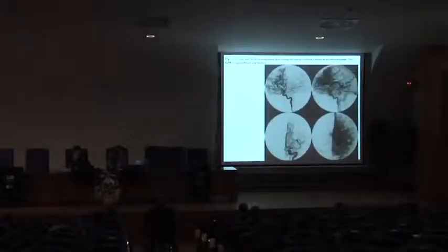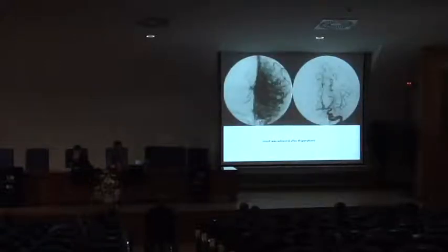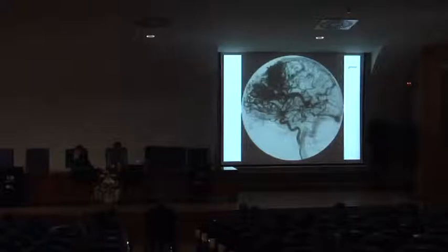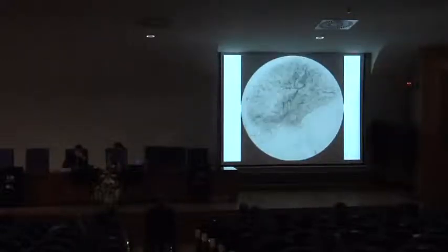And as the patient has thrombosis of the sinus rectus, it's very dangerous, because after occlusion of the draining vein there is a danger of rupture of the malformation. Catheterization transarterially and transvenously, and you can see the result preoperative and unbelievable post-operative result.